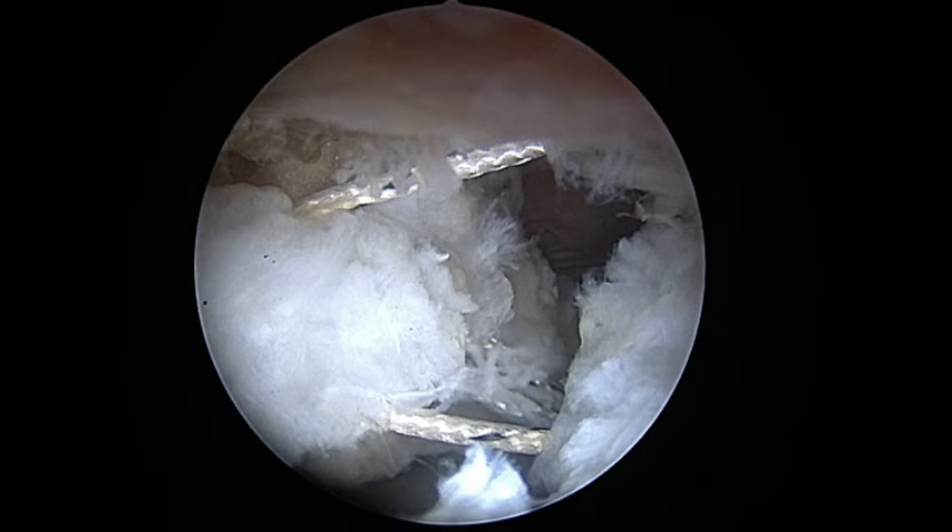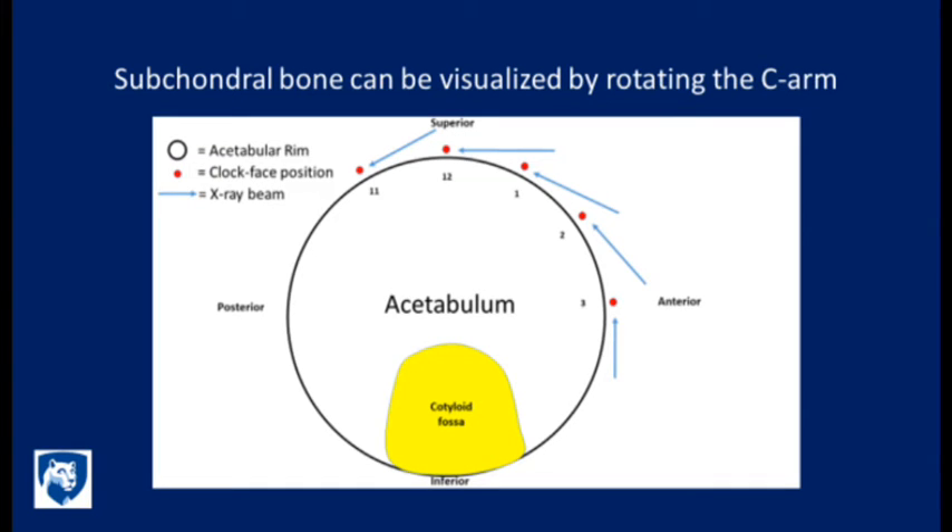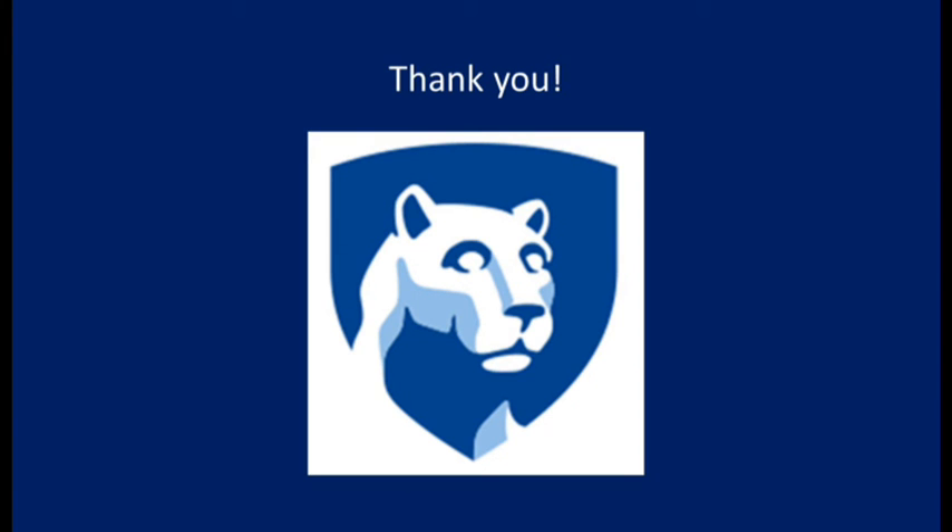Finally, since this is a case of hip instability, three capsular plication sutures are placed and tied down. The surgical pearl of this technique is that tangential C-arm fluoroscopy views will allow for visualization of the subchondral bone to guide suture anchor placement. Thank you very much for your attention.